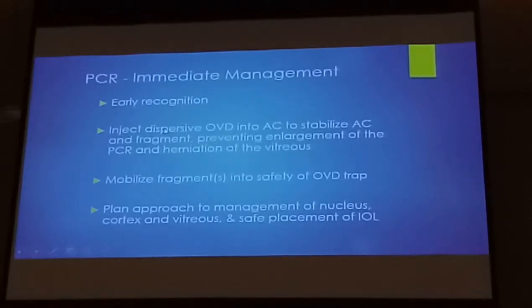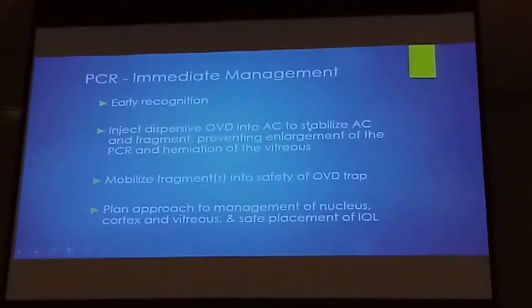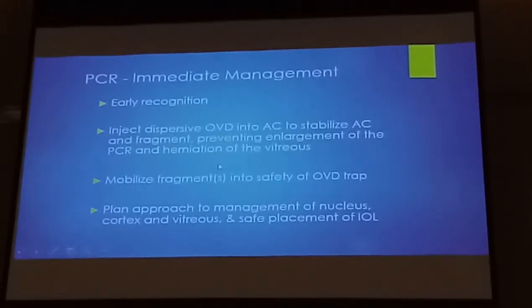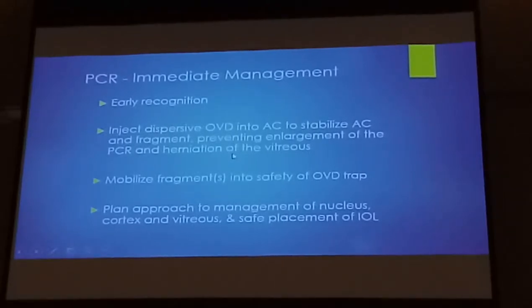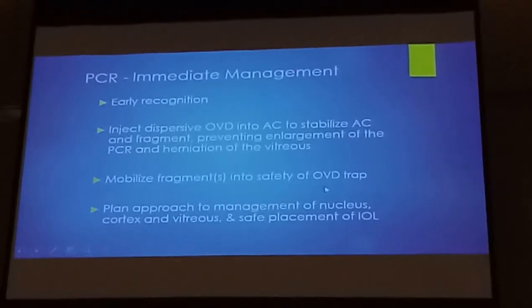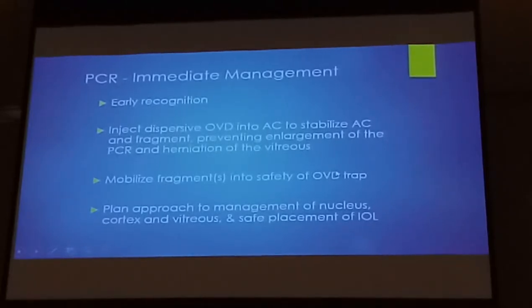The next thing to do — if you're panicking and your hands are starting to shake — you must remember: before you pull out instruments, inject dispersive OVD into the anterior chamber, something like Viscoat, to stabilize the anterior chamber and the fragment. That will prevent enlargement of the PCR and vitreous coming forwards. Then you want to move any remnant fragments into this dispersive OVD trap. It's important that it's dispersive, so that even if part of that dispersive OVD is removed by the phaco tip, the fragment doesn't fall back through the PCR — because the dispersive OVD forms a trap for the nucleus in the anterior chamber. It keeps it there so you can clear the vitreous if there's any. Then you think about and plan your approach to management of the remnant nucleus, the cortex, the vitreous, and how you can place the IOL.